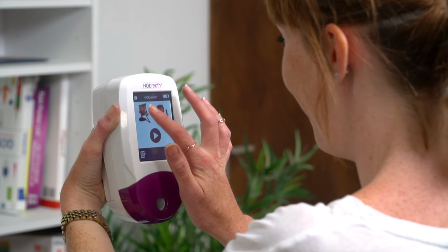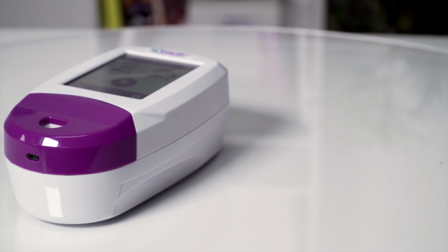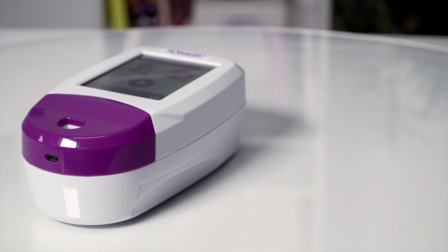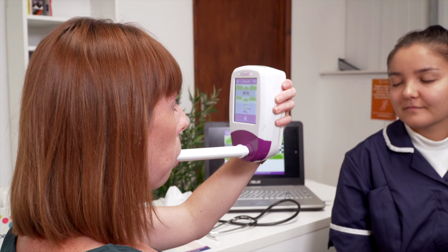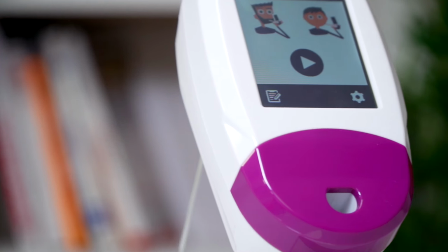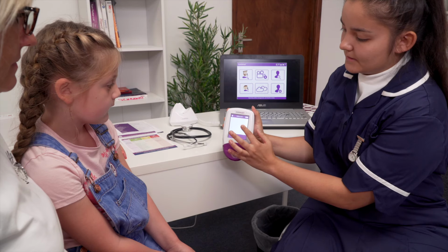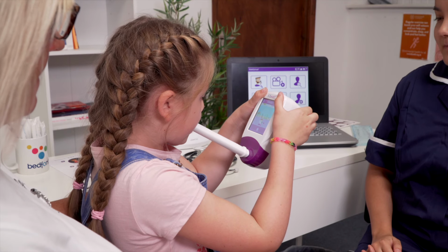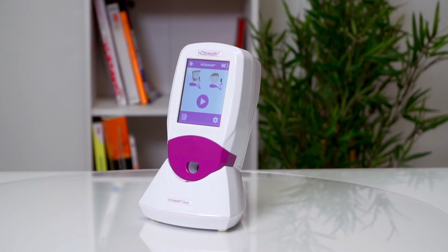The NObreath, a handheld FeNO monitor, is recommended by NICE and conforms to ATS and ERS guidelines. The NObreath makes FeNO monitoring quick and easy, plus it's completely non-invasive, with the ability to monitor airway inflammation in both adult and child patients. Furthermore, the ambient monitoring mode enables you to check ambient levels of NO.